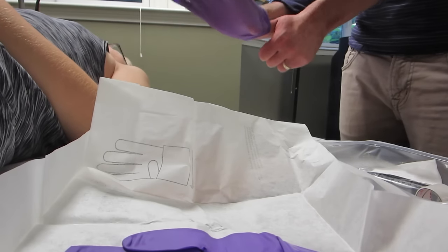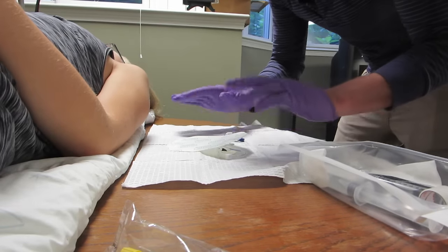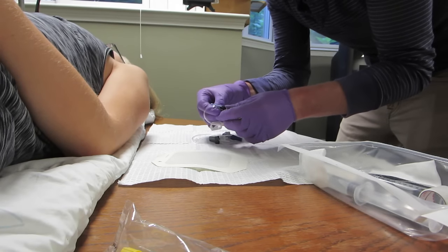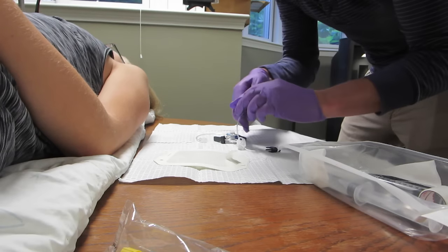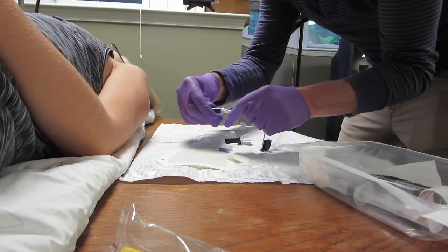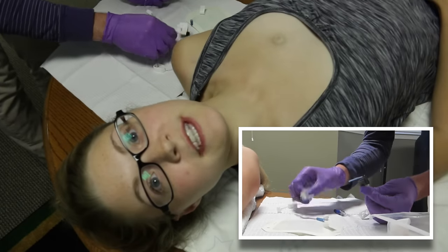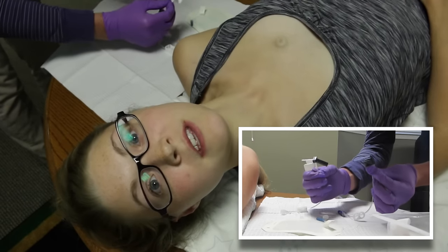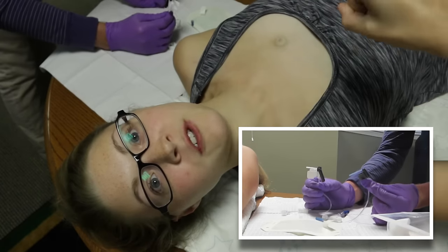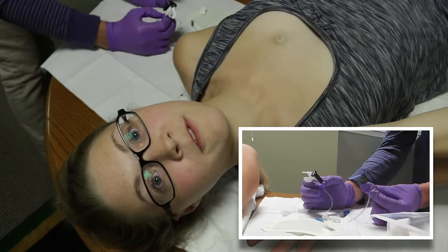Now that the gloves are on, set up the station. Grab the needle and connect it to the cap by screwing them together. The needles used for a port-a-cath are called Huber needles — some people call them gripper needles. Basically it's a needle that is bent so that when you insert it into the port it isn't sticking straight out. There are many different styles of needles.